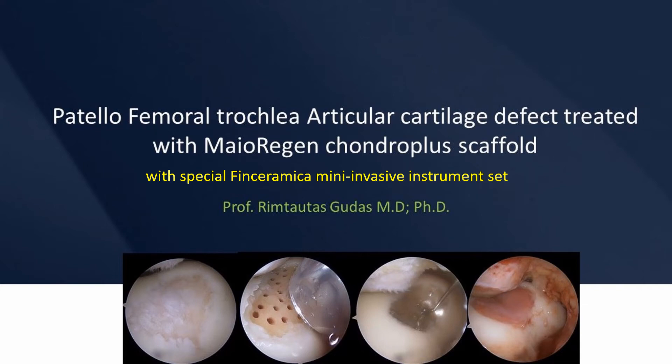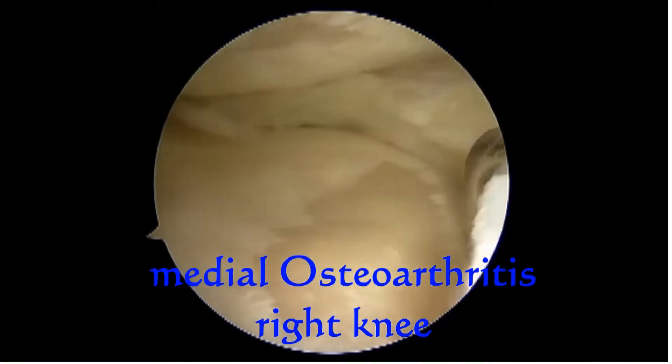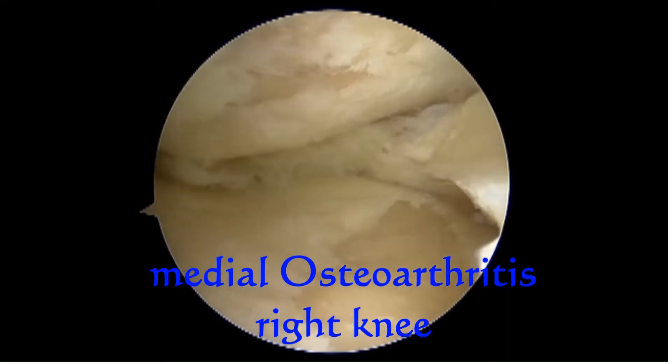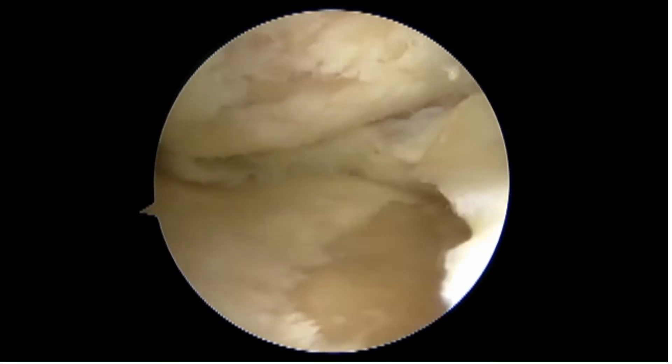We present a clinical case of arthroscopic implantation of the Myoregian Chondroplus scaffold in the medial femoral condyle using special Finceramica mini-invasive instruments. Medial osteoarthritis of the right knee was diagnosed for this patient.